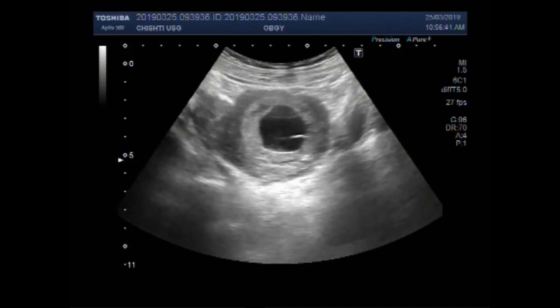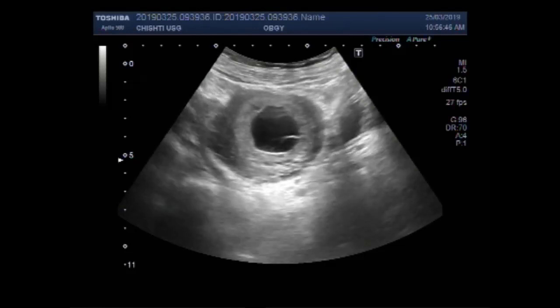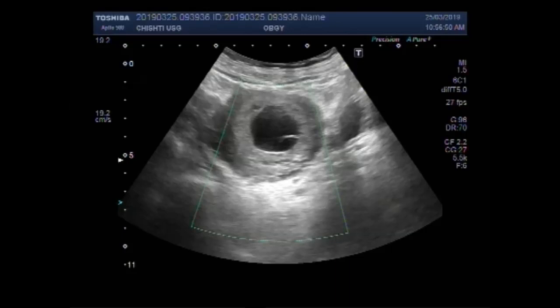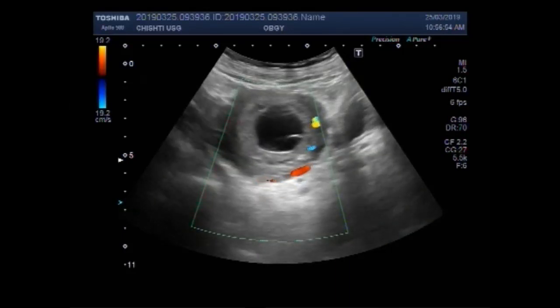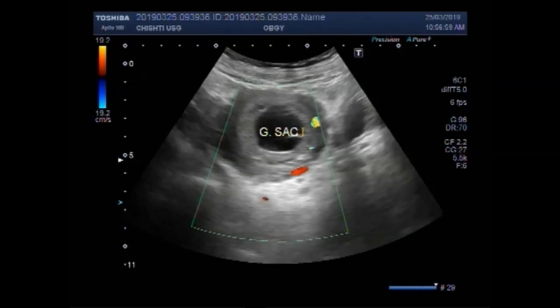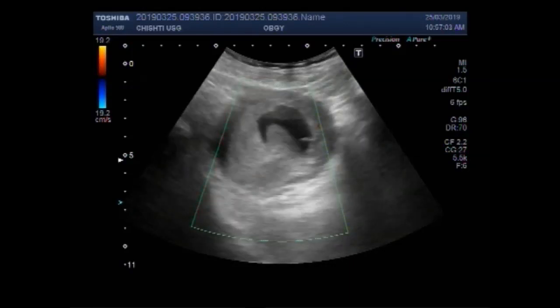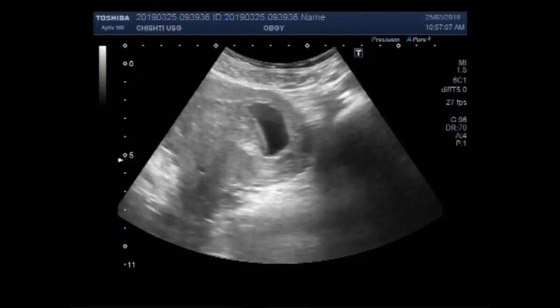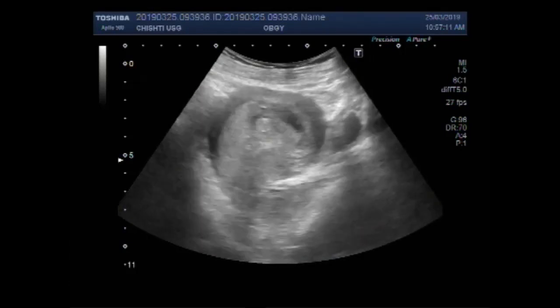You can see the gestational sac in the uterus without a fetal pole visible in its interior. No blood flow is seen inside the gestational sac, and no products of conception are visible.